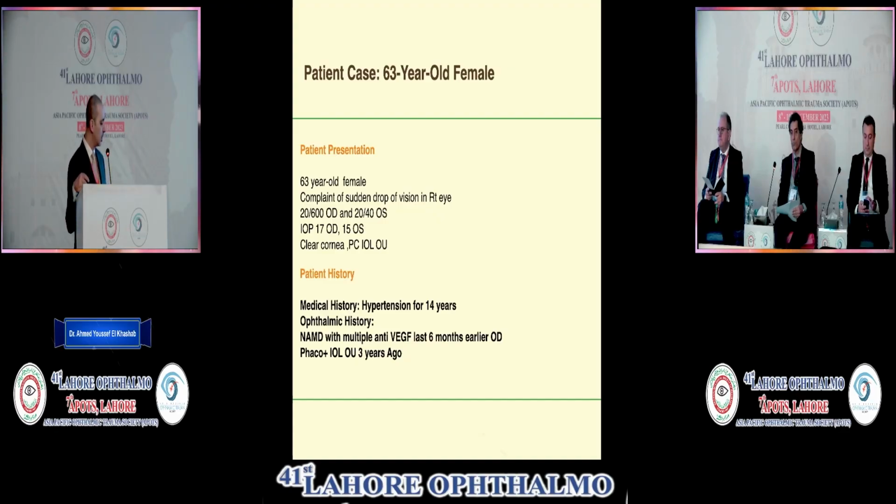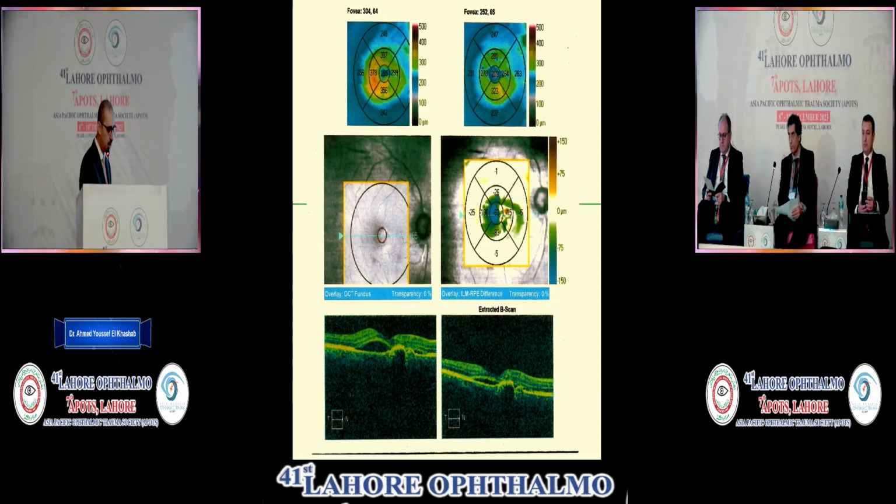This is actually a secondary case. She presented to me 2 years prior with an active choroidal neovascular membrane. For that, she received multiple anti-VEGF injections, the last was 6 months ago. This was the OCT at presentation 2 years back.